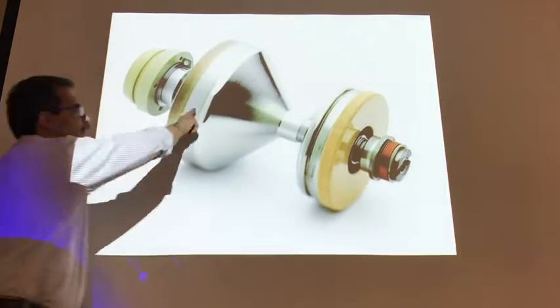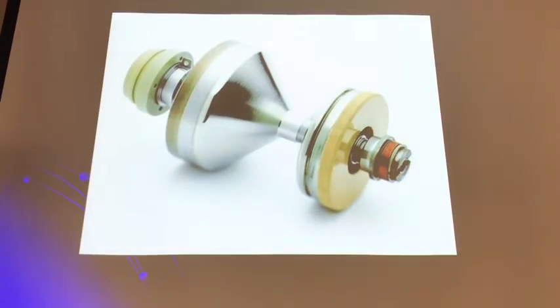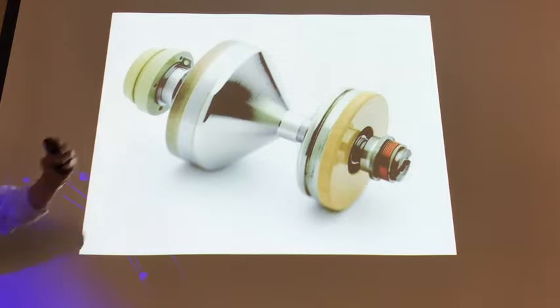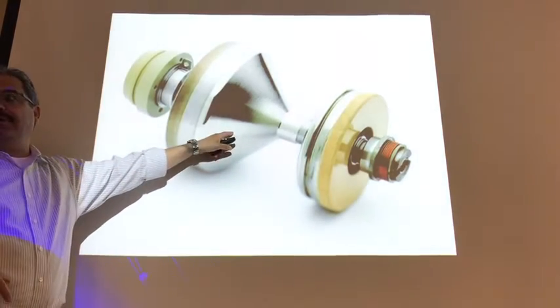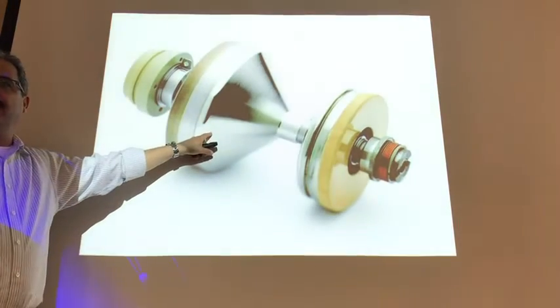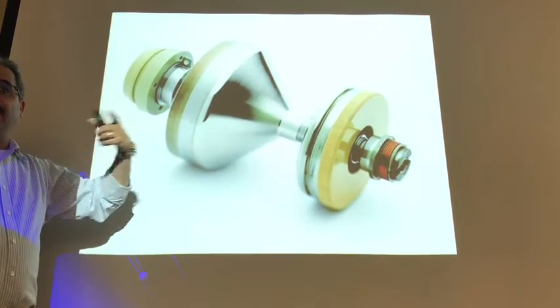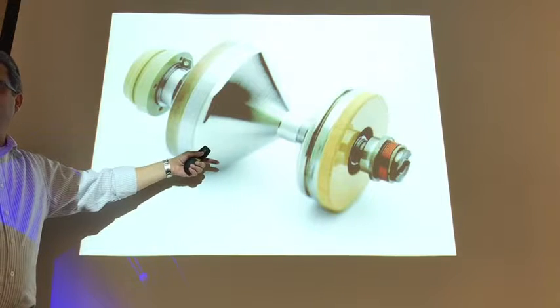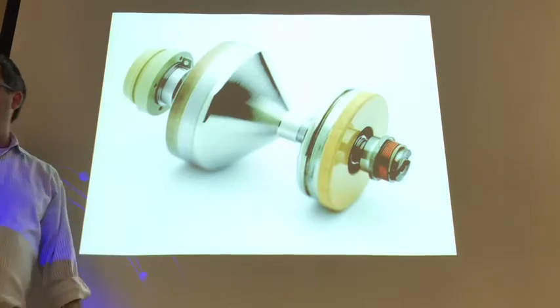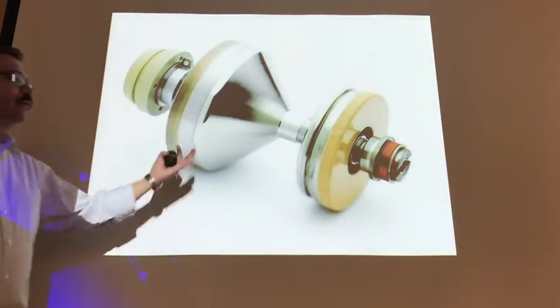They're always directed here. And they use magnetic fields within the tube so the electrons don't spread. Remember that was the problem with the glass tube? You have the focusing cup, and while they're in the focusing cup they are compressed, but once they leave, they spread. That doesn't happen here. That's one of many advantages you have with metal, that you can put through metal a small current, right? But can you do that with glass? No. Glass is not a very good conductor.